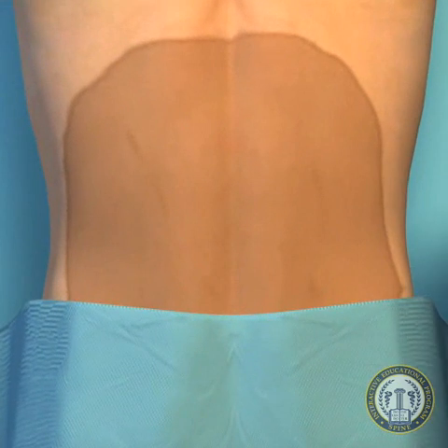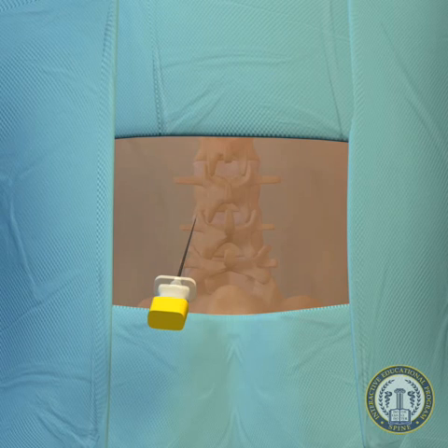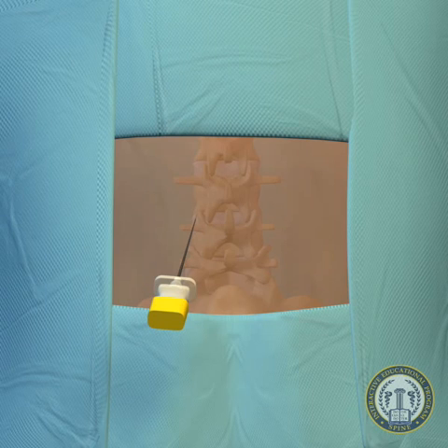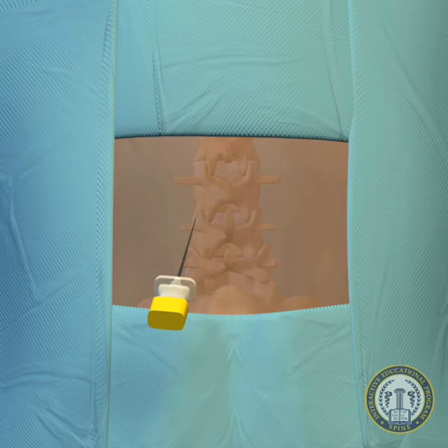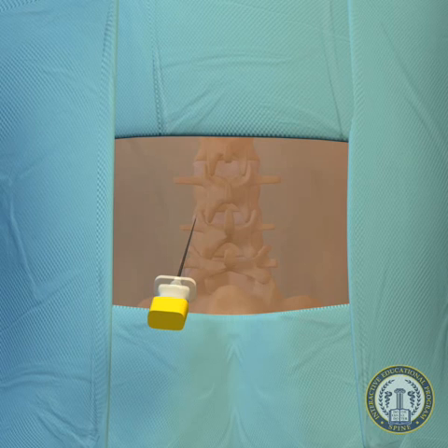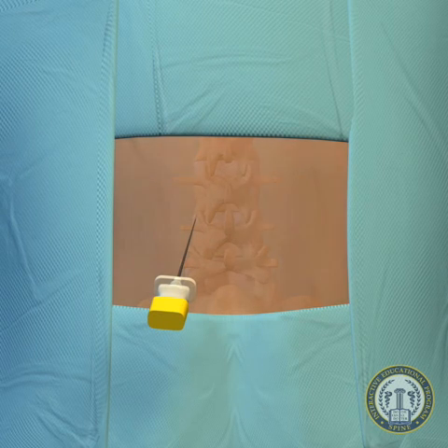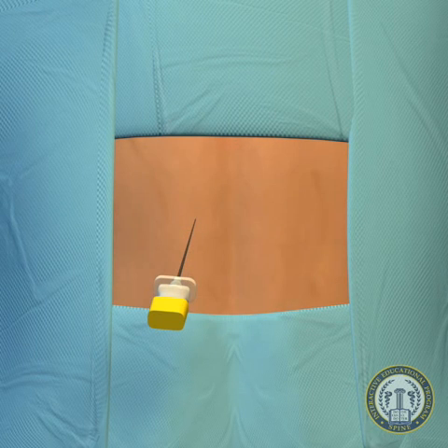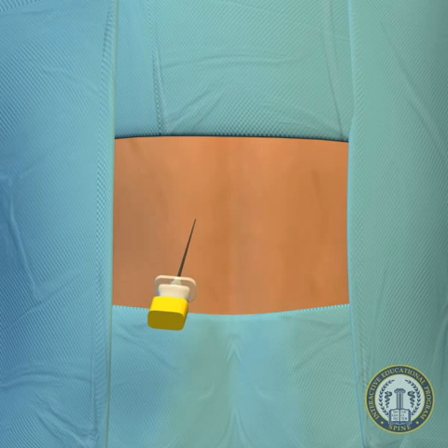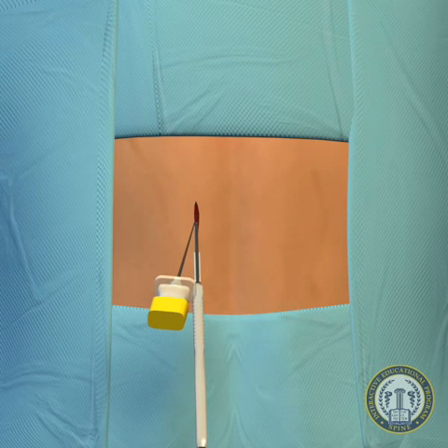After the patient is draped, a 22-gauge spinal needle is inserted into the skin directly over the ipsilateral disk space of interest. The needle is used to identify the trajectories of the screw placement and to ensure an accurate extent of the incision. For a single level procedure, a 2.5 cm skin incision is centered over this point.